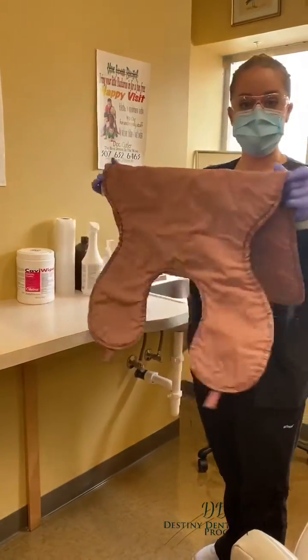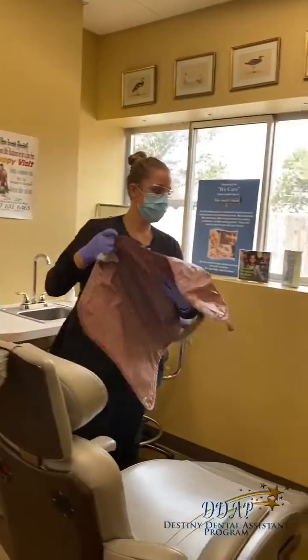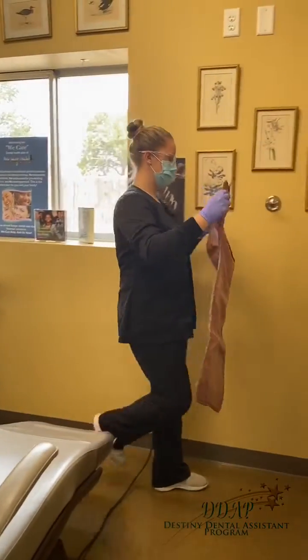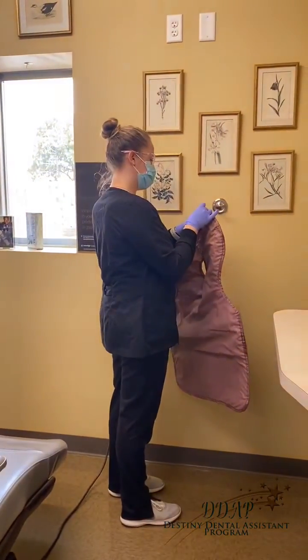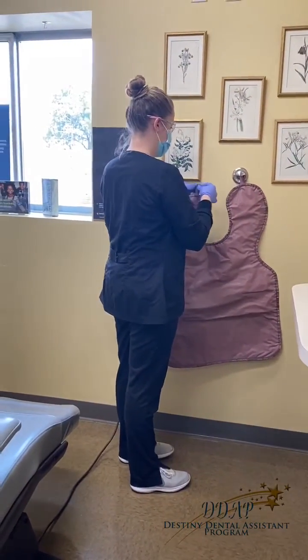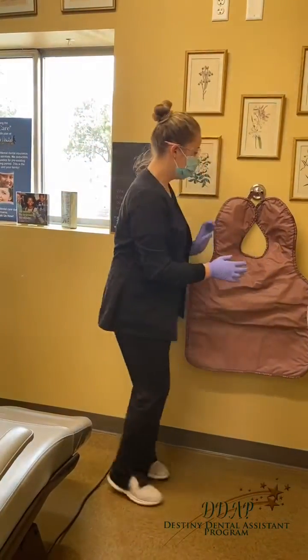There is our lead apron that we just wiped down, and she'll hang it up. We let that air dry. If we fold too much of the lead apron, it will make little cracks in it, so we try to keep it up.